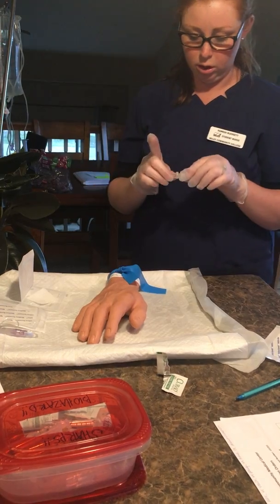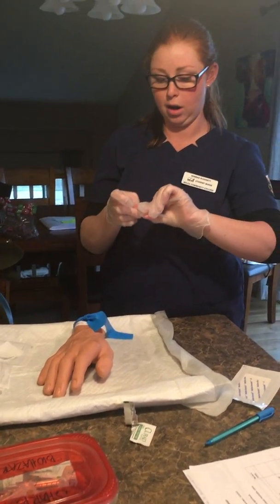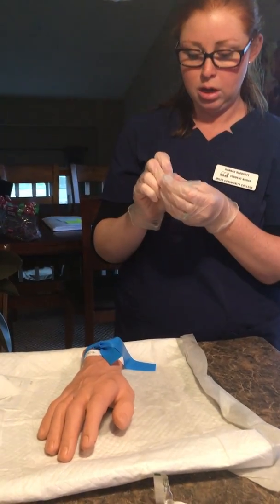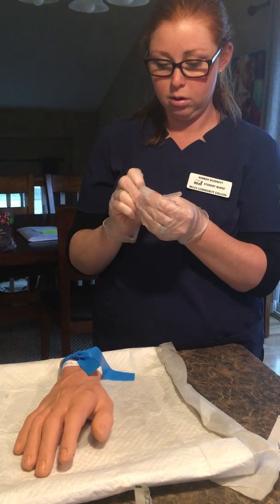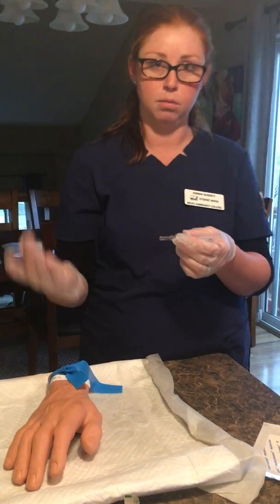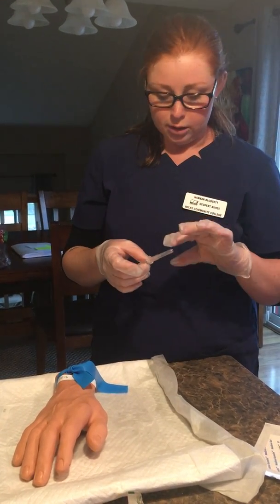Okay, fingers still clean. So probably before I do anything, I'm going to want to loosen the end of the catheter a little bit so that it can be easily pulled from the end when I'm ready to insert the catheter after I've gotten that situated.